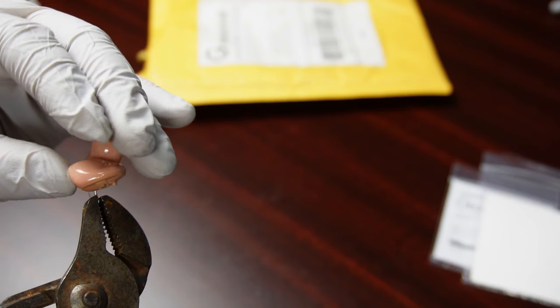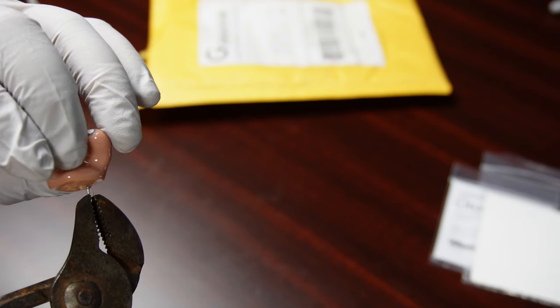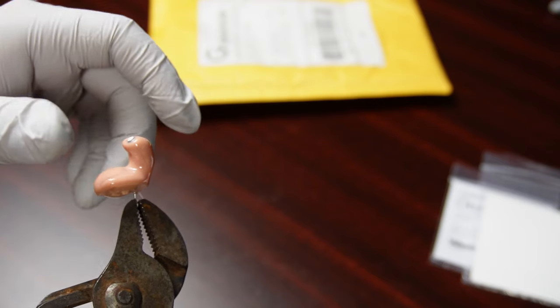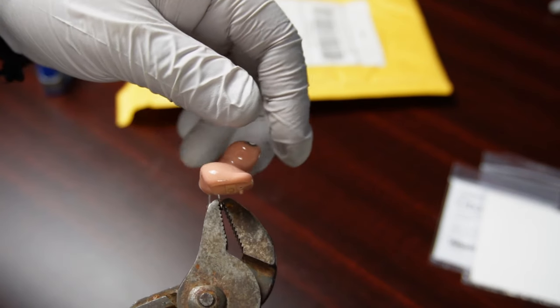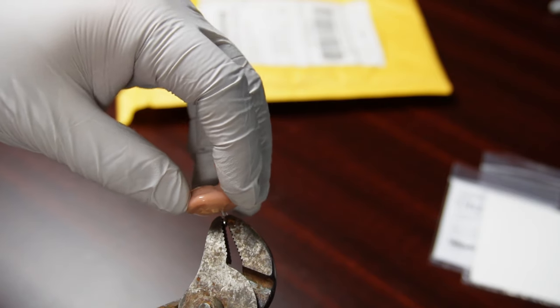Again, you don't have to rush, you don't have to move quickly. Slow is smooth and smooth is fast. And you don't want to screw the eyelet in until it completely stops, until it's completely buried. I leave probably a good quarter of an inch of the stem out, because you don't want to run out of threads.